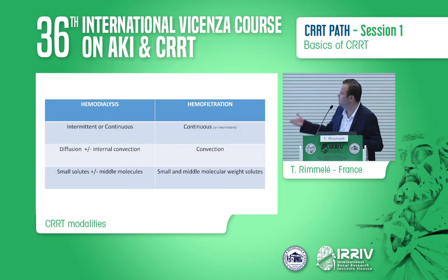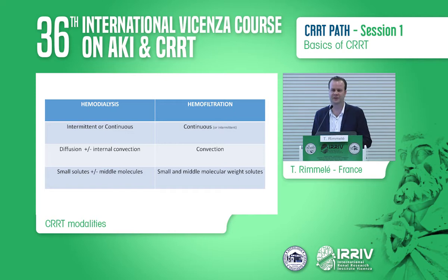So I would correct this table a little bit, saying that hemodialysis can be used, of course, as intermittent hemodialysis, but also as continuous hemodialysis. And we do a lot of continuous hemodialysis in my institution. For hemofiltration, it's of course continuous hemofiltration for almost 95 or 98% of the sessions, but some teams are assessing intermittent hemofiltration as well.